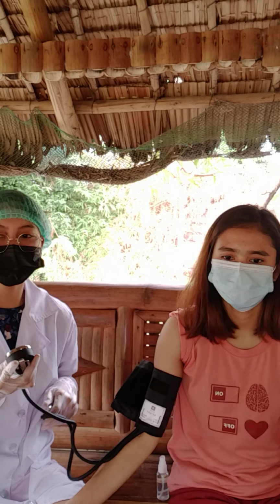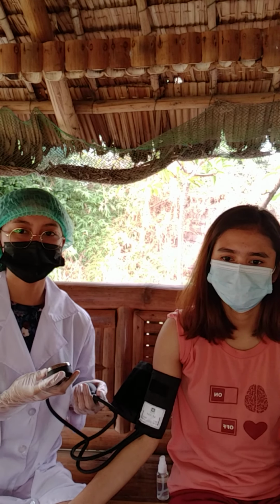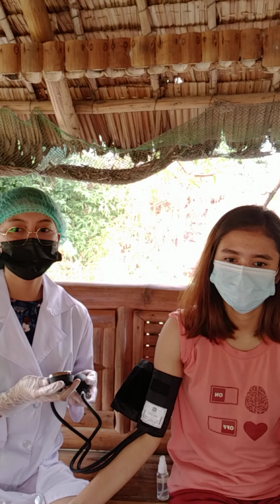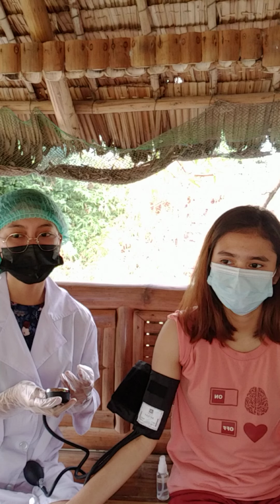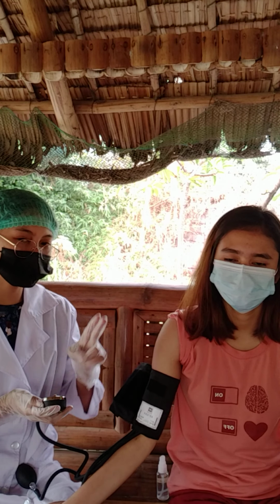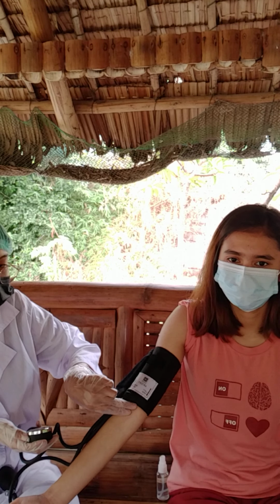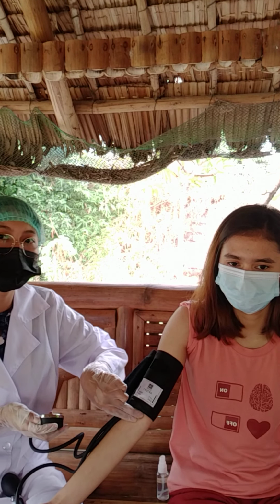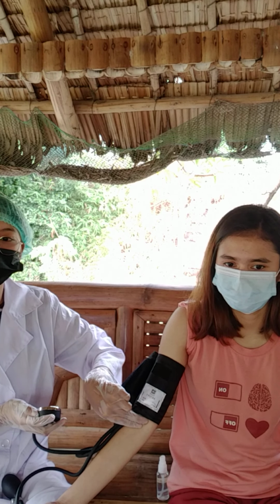And then, after that, estimating the systolic pressure of the patient. So, palpate the pulse at the brachial or radial artery by pressing gently with the fingertips. So, through the use of this finger, ilalagay natin siya dito sa may brachial artery niya. Hanapin natin yung pulso. So, yun, nahanap ko na yung pulso niya.